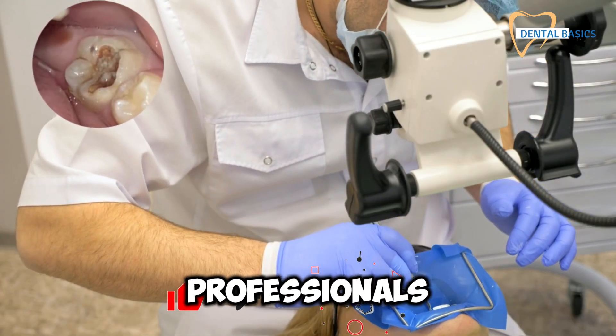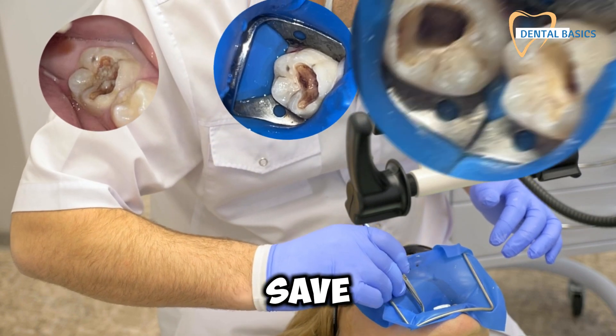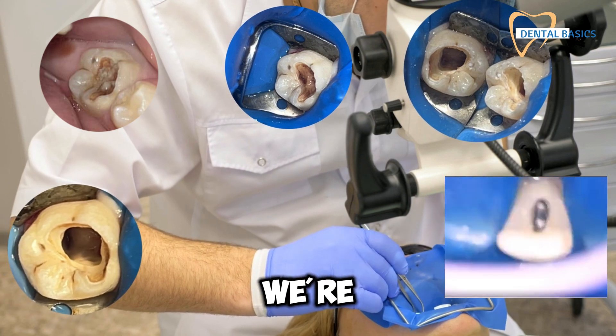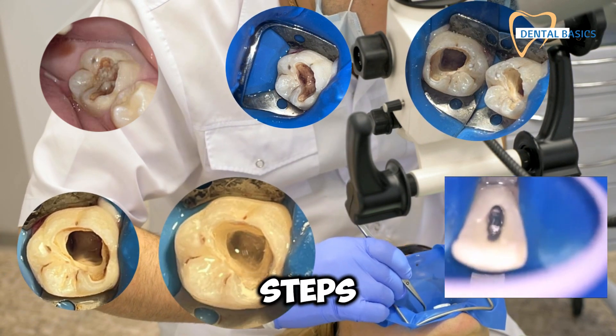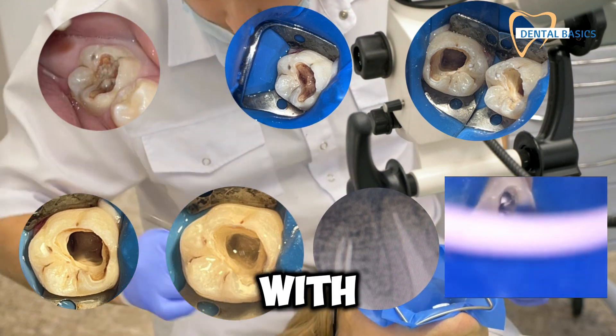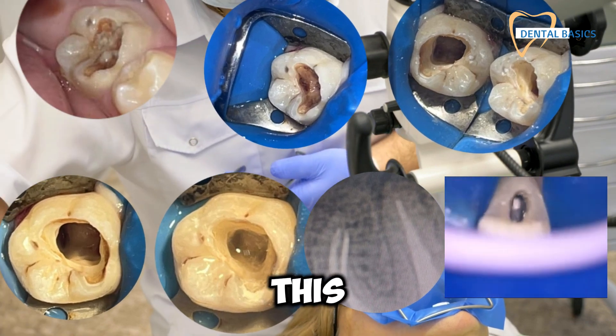Hey there, dental professionals. Are you ready to master the game-changing procedure that can save immature teeth and elevate your practice? Today, we're breaking down the essential clinical steps of apexification, a must-know technique for any dentist dealing with non-vital pulps in immature teeth. Trust us, you don't want to miss this.